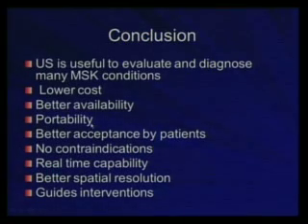So ultrasound is a useful tool to evaluate and diagnose many MSK conditions. It has a lower cost than MRI. It has better availability, portability, better acceptance by the patient. It has no contraindications. It has real-time capability. It has better spatial resolution than MRI, but that doesn't mean too much because MRI has better contrast resolution than ultrasound. And ultrasound can guide interventions.